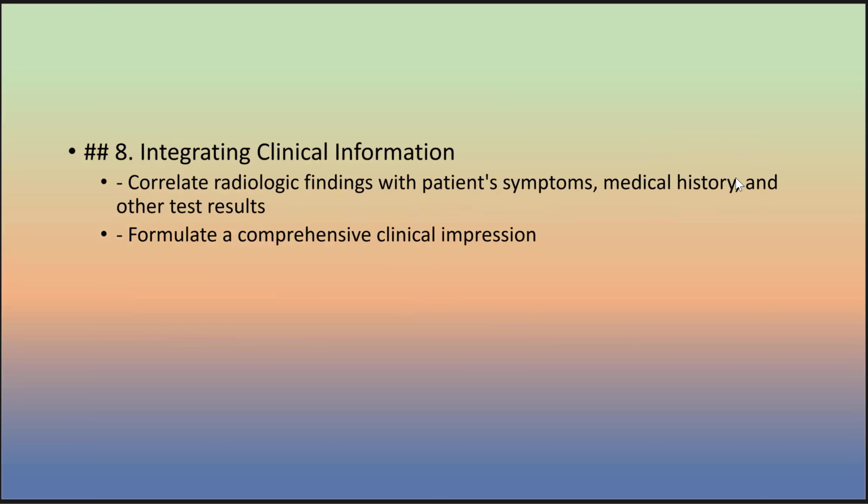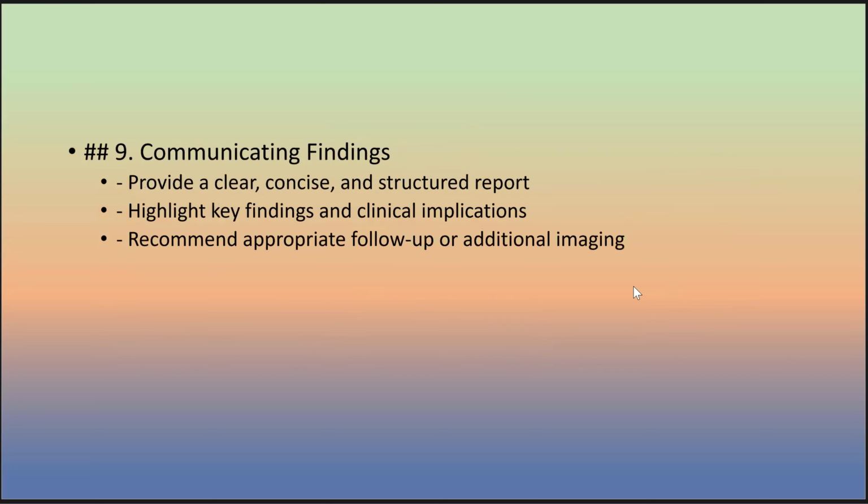Integrating clinical information: correlate radiological findings with the patient's symptoms, medical history, and other test results. Formulate a comprehensive clinical impression. Communicating findings: provide a clear, concise, structured report, highlight the key findings and the clinical implications, and recommend appropriate follow-up or additional imaging.